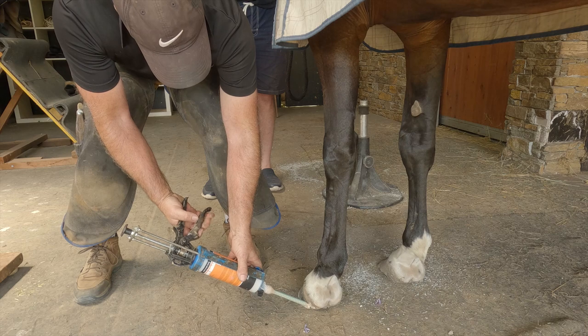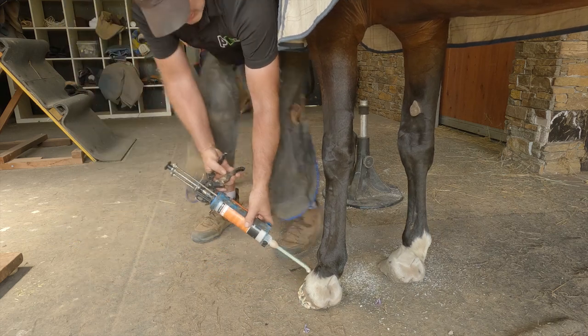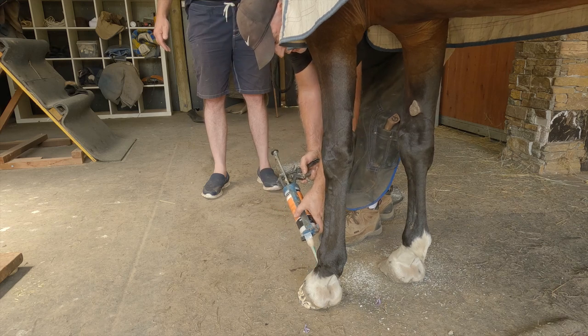I first apply glue to the hoof capsule, ensuring I go right to the heels, as this is generally the first point of failure due to expansion of the capsule.